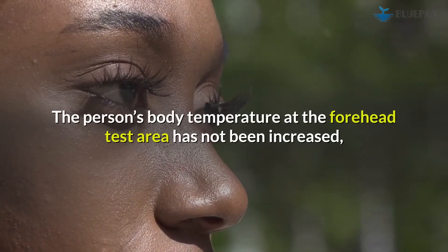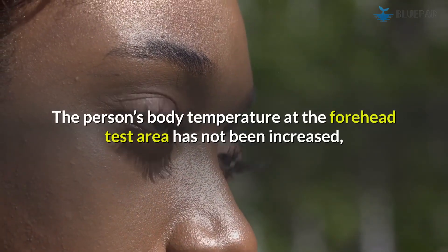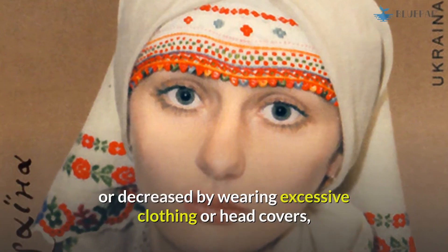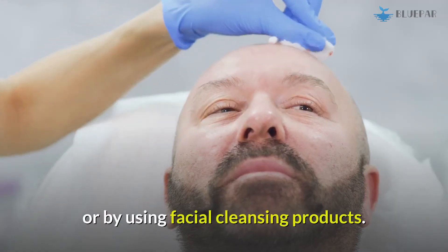The person's body temperature at the forehead test area should not have been increased or decreased by wearing excessive clothing or head covers, or by using facial cleansing products.